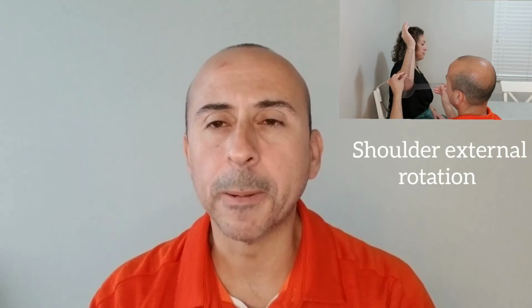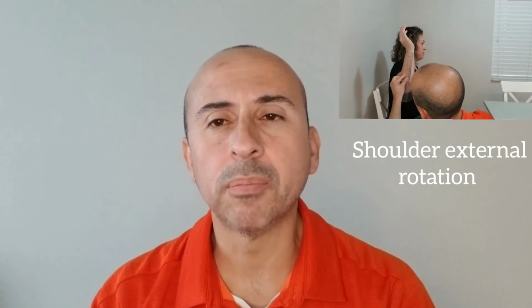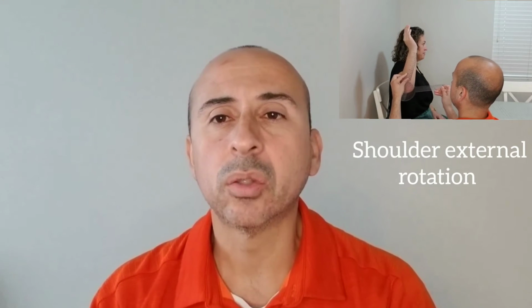If you have an arthritic or malformed joint, you're going to be very careful with that and pay attention to the end feel as to what that looks like, and obviously using your client for feedback and observing their facial expressions and their eyes or what they're saying to make sure that they're comfortable during the whole process and that we're not doing anything that's not comfortable for them.